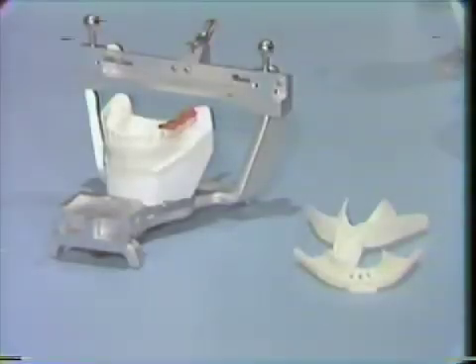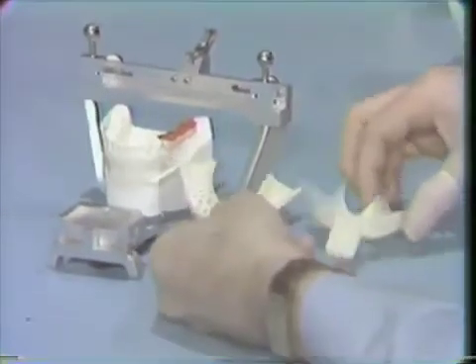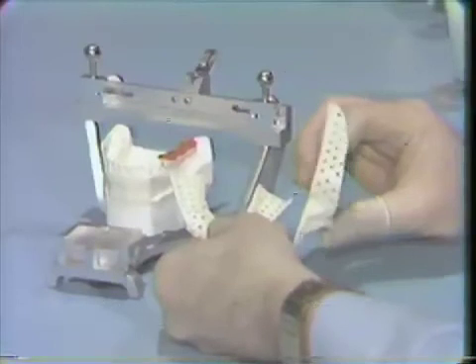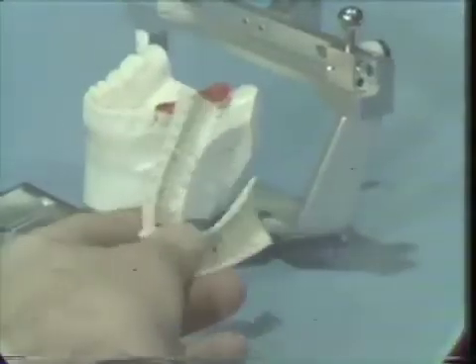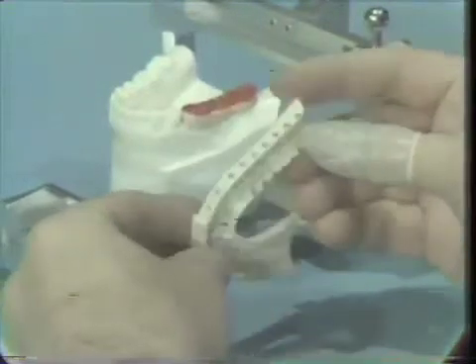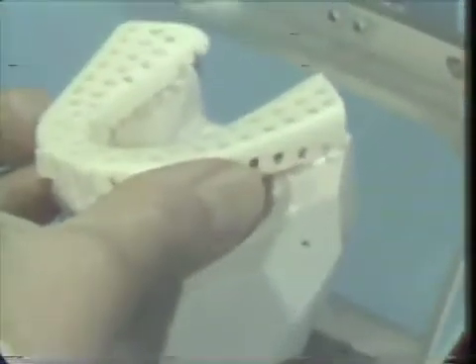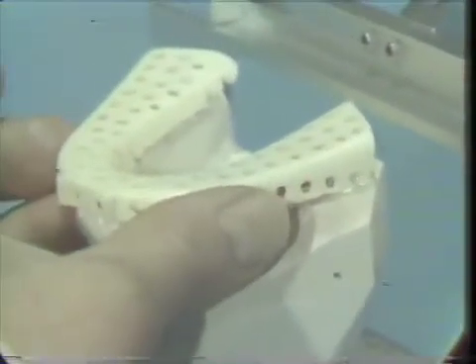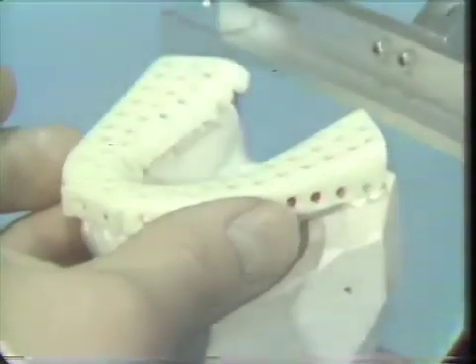We're now ready to do our direct pickup in the mouth, and we've taken a stock disposable acrylic tray and cut the flange down, as you see here, and also removed the handle. And this we'll use to make our stone key registration of the functionally generated registration directly in the mouth.